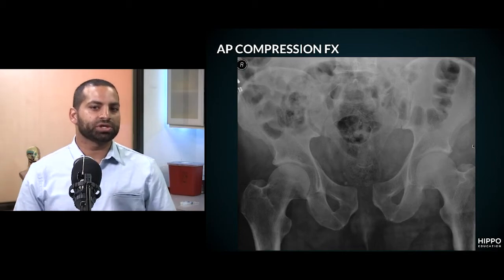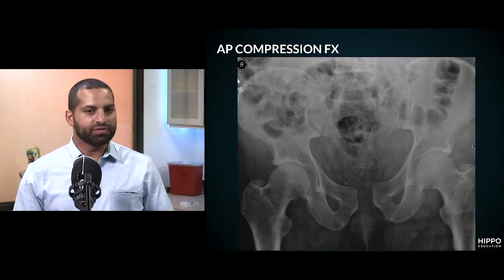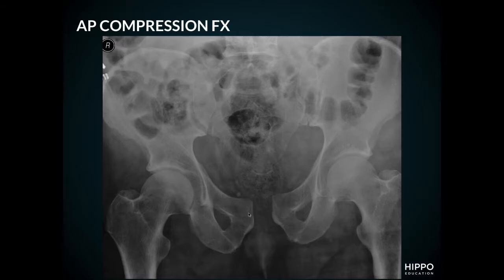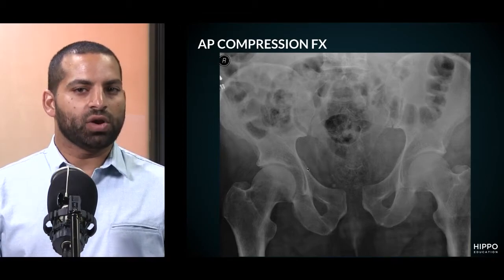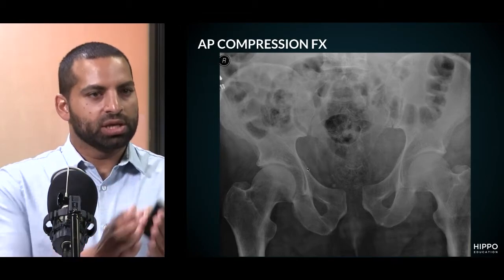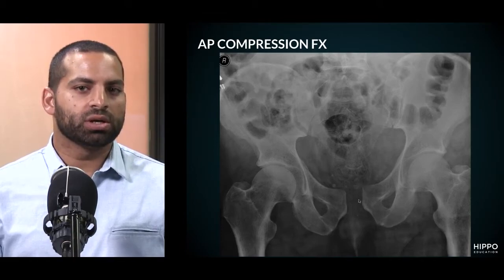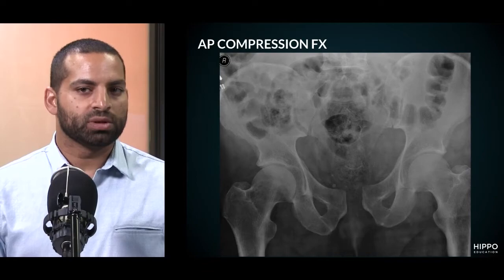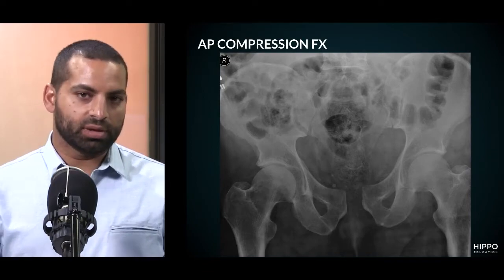Moving on to anterior-posterior compression fractures — imagine something squeezing the pelvis in an anterior-posterior dimension. You're seeing widening of the pubic symphysis. Because it's a rigid ring, if you see widening of one joint, look for a fracture or widening of another. Following the left iliopectineal line, the left sacroiliac joint looks normal, but then the right sacroiliac joint is widened. This is called an open-book fracture — imagine a book opening, with the pubic symphysis as the spine of the book and the whole pelvis opening up.